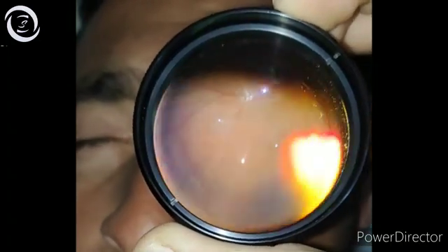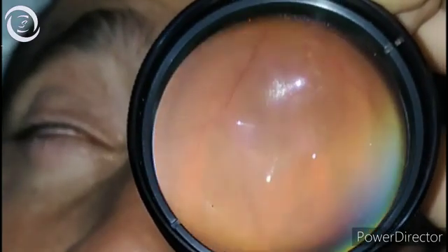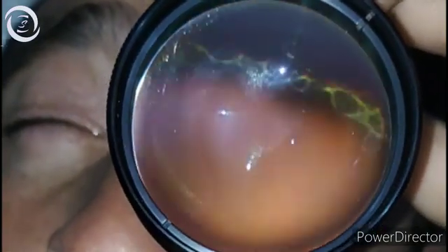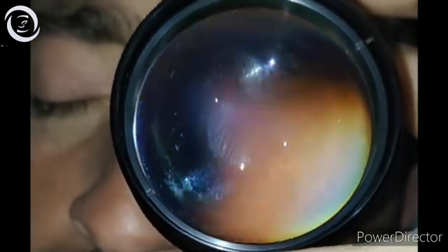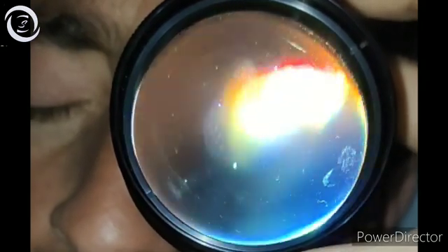Hi, I am Dr. Sharjee, and today I am showing you the fundus of this young male myopic patient who underwent clear lens extraction under topical anesthesia a few weeks back by me, for his very thick myopic glasses. You have seen his clear lens extraction, and today I am showing these numerous peripheral retinal lesions — these black and white condensations of the peripheral retina, these small islands of lattice with an arborizing network of white lines — using a smartphone flashlight and a 20-diopter lens. Today's video is about peripheral retinal degeneration.